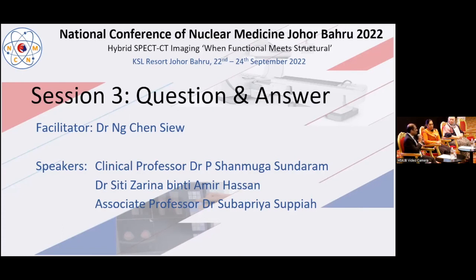That's where the SUV reduction means always look for 50% reduction. Then you commit that it is a response. If it is less than 50% or lesser than 25%, be careful in reporting that. So these 3 points we should keep in our mind.